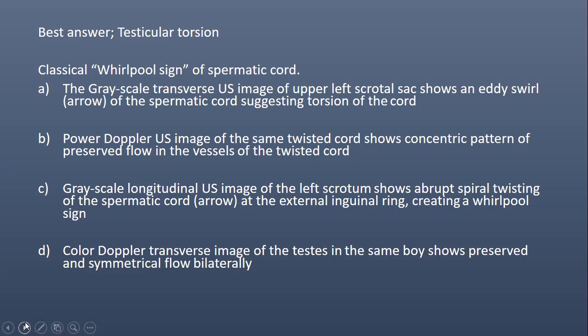Most of these clinicians won't understand these terms if you bombard them with them, except the specialists who have been seeing these scans over and over again, and they know the terms that you are using. Okay, so we can go to the next slide.